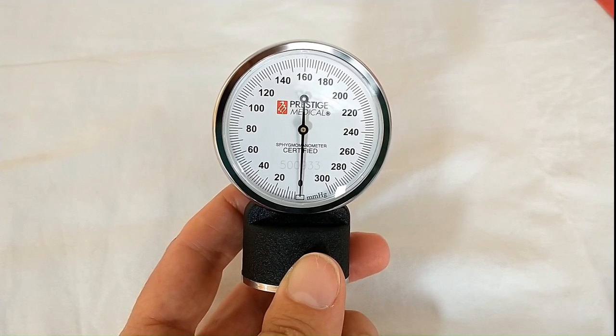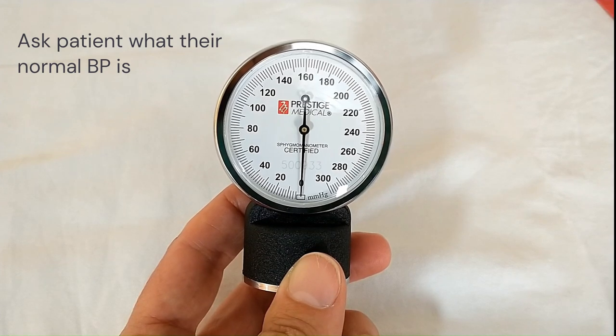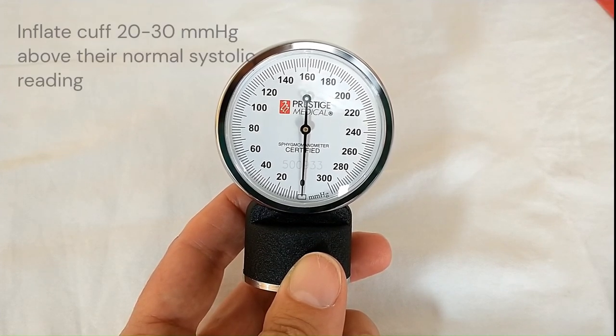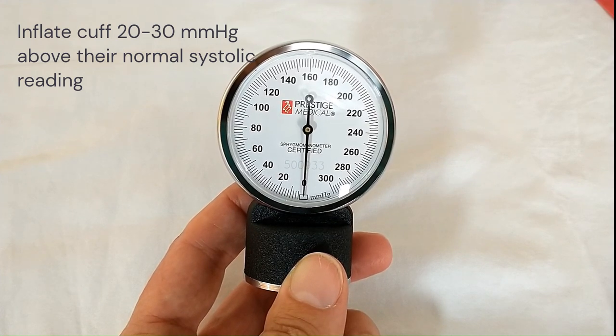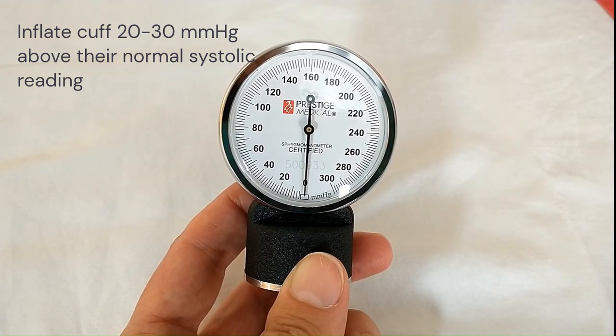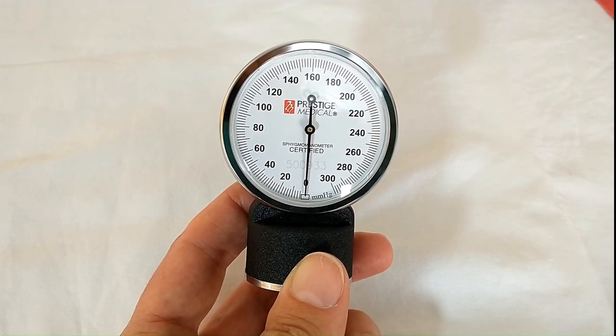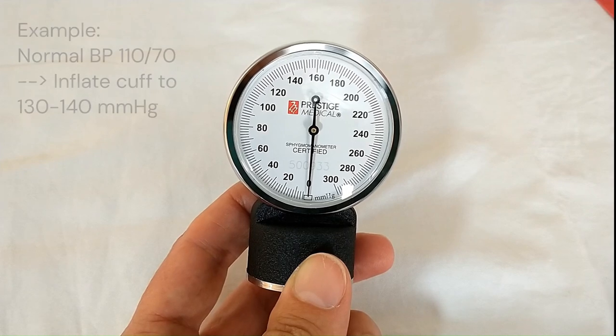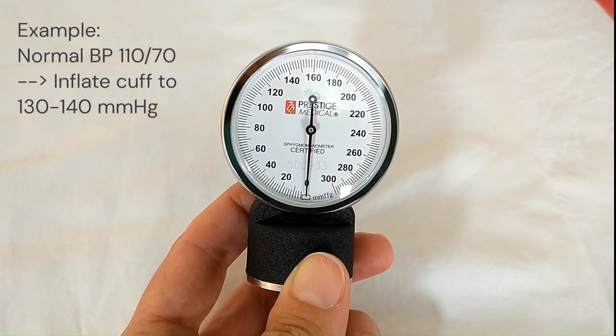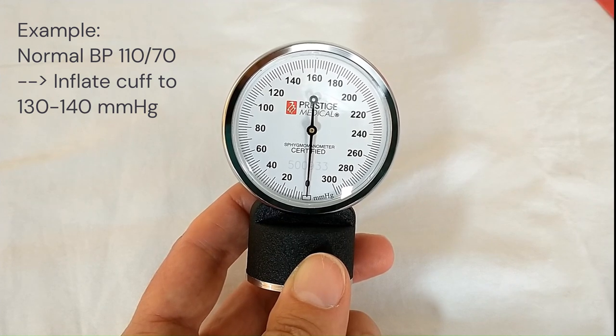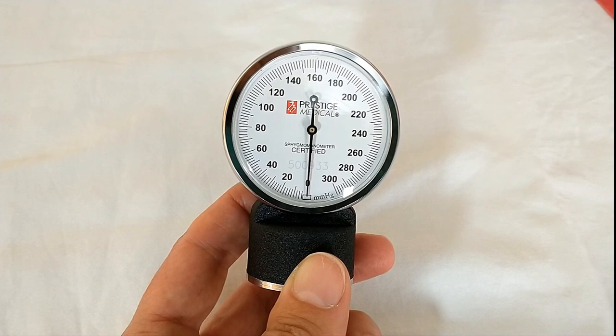It is very important that we assess the patient and ask them what their normal blood pressure is, and then inflate the blood pressure cuff to approximately 20 to 30 millimeters of mercury above their normal blood pressure. So for example, if the normal blood pressure is 110 over 70, we would inflate the cuff to approximately 130 to 140, and then slowly dial it so that you can easily see their normal blood pressure.